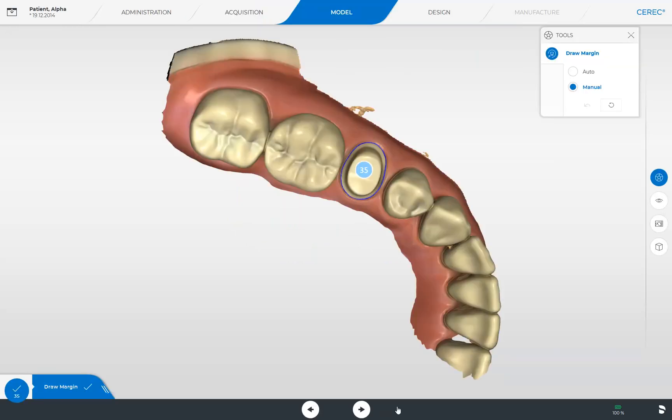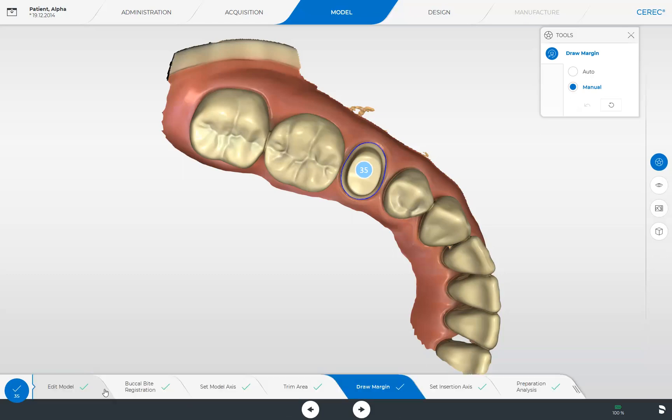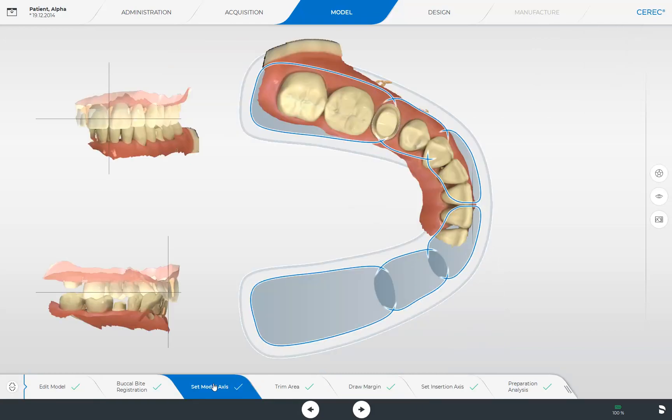When reaching the model phase, you can check all steps and make corrections if needed. To expand the step menu to full size, we tap the two parallel lines. The green check mark in each step indicates that the CEREC software has performed each step automatically. Just for demonstration purposes, we switch back to the step Set Model Axis. You can clearly see that the model axes have been ideally positioned automatically. For this to happen, a sufficient number of adjacent teeth need to be scanned both in the upper and lower jaw. It is recommended that a minimum of two to three teeth, both to the mesial and distal direction, are scanned.